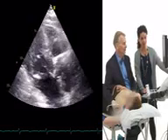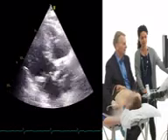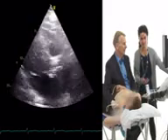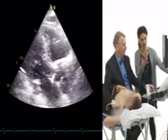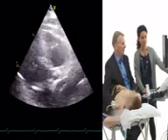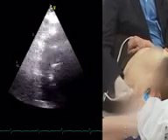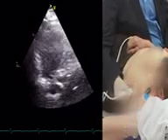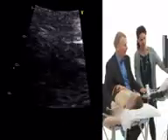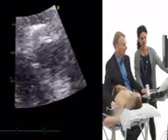Right, so the question will be, is this really her problem? Does she have aortic stenosis? So the degree of calcification will be important to look at. And the valve is calcified, but still the cusps open. Yeah, I think so too. There's some opening of the cusps, very difficult to see, but I will go to a short axis view. And I think you can appreciate that there is some motion of the aortic valve here. I'll maybe use the zoom view just so that you get a better feeling for the valve.